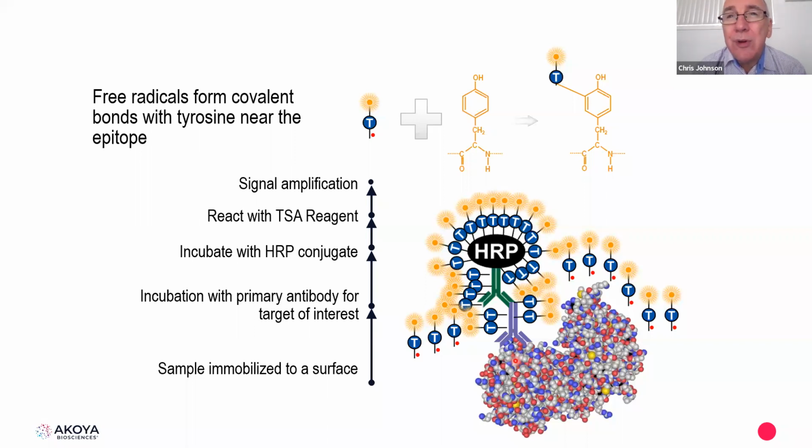You want to put your higher expression antibodies on there. And the reverse goes the other way. For the very bright dyes that you have, 480, 520, these should be placed on the antibodies that are not so expressive.